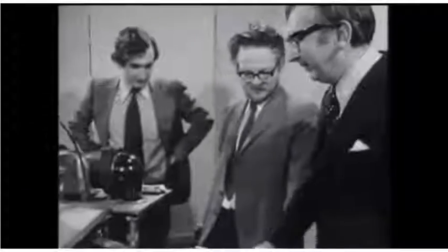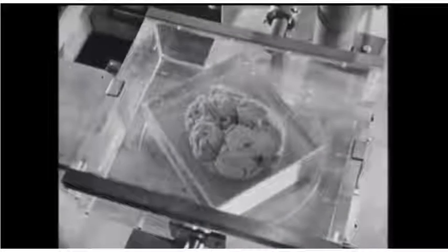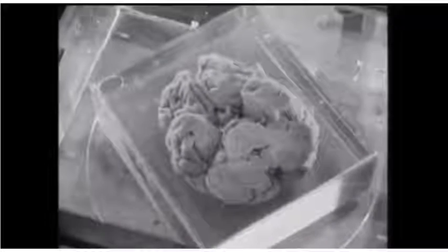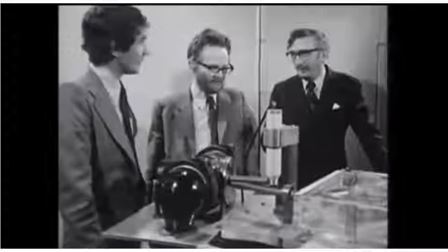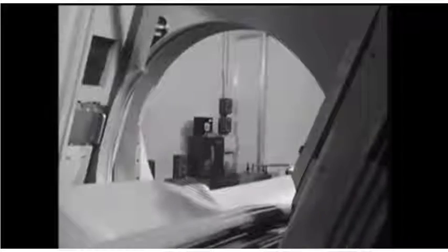Hounsfield searches for specimens where he can find them. I had to go around to abattoirs and cut out brains from cows, but unfortunately these were damaged by their method of killing, so that we found ourselves travelling across London to the Jewish kosher houses, which killed by bleeding the bullocks. And it was quite a job carrying these across London in a paper bag to put on the machine. The ventricles did show up very well, and it was just a matter then of making a clinical machine.